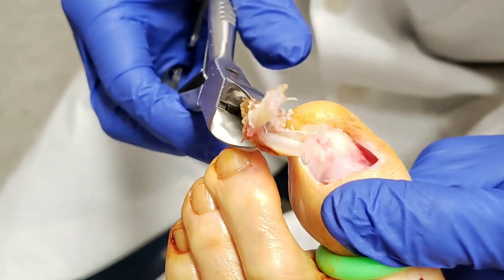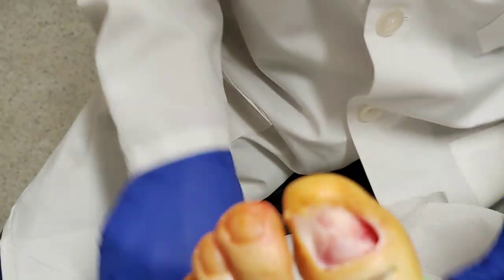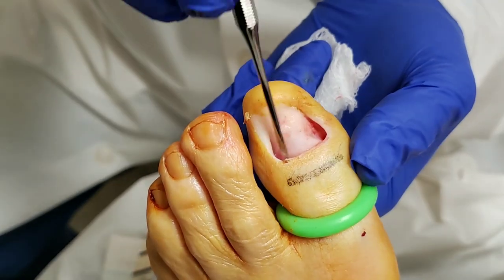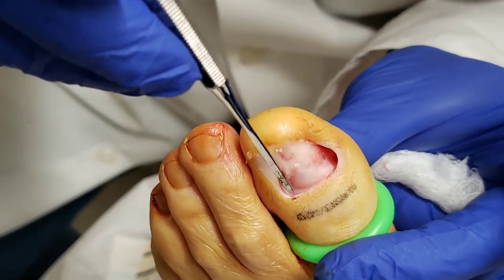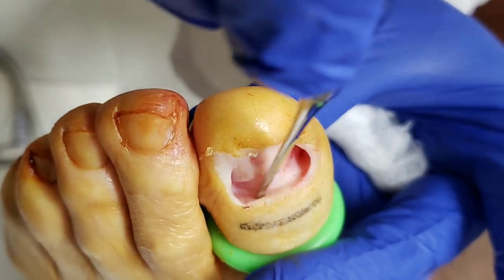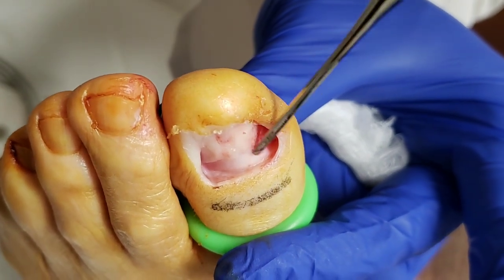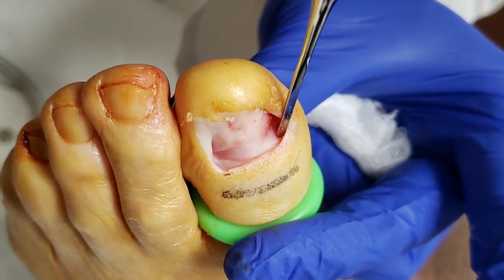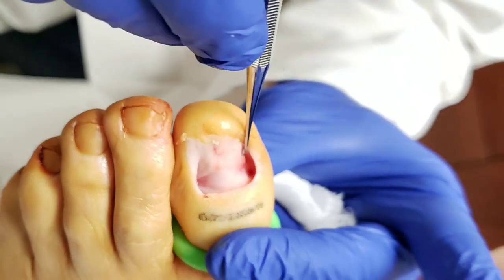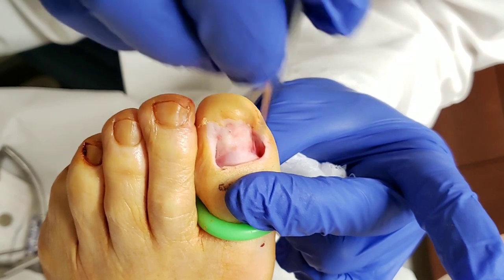And that's the nail base right there. This is that other portion of the nail that was removed. And you can see because of the thickened nail for such a long time, there are these little grooves in here that aren't typical. You can see kind of the inside — the area of the root is way back here, underneath the skin in this area is where the nail grows from. Some of the nail grows from the top and I try to put the sodium hydroxide on there, but I want to get it all the way in the back too.